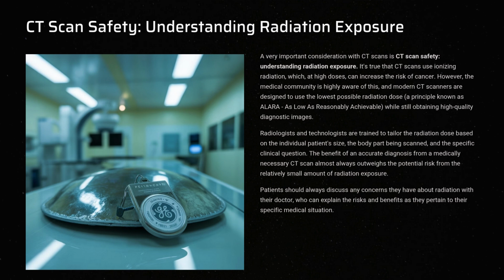CT scan safety, understanding radiation exposure. A very important consideration with CT scans is CT scan safety. It's true that CT scans use ionizing radiation, which, at high doses, can increase the risk of cancer. However, the medical community is highly aware of this, and modern CT scanners are designed to use the lowest possible radiation dose, a principle known as ALARA, as low as reasonably achievable, while still obtaining high-quality diagnostic images.